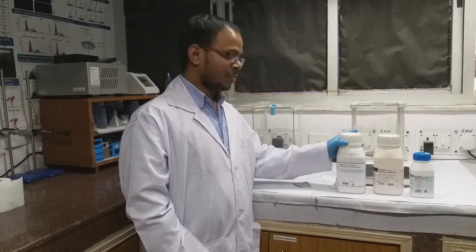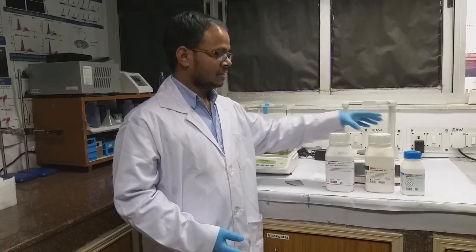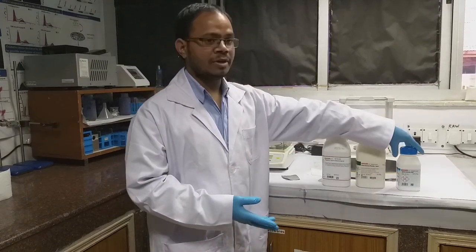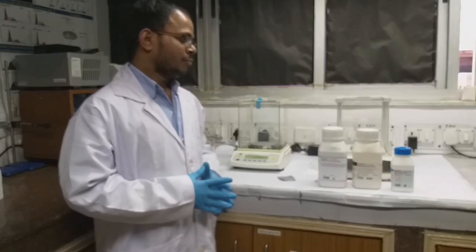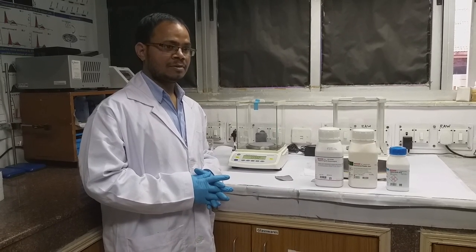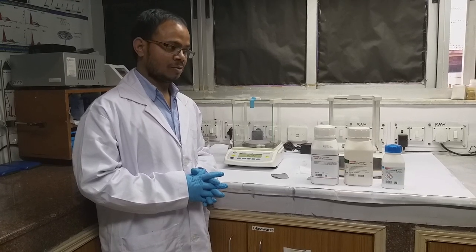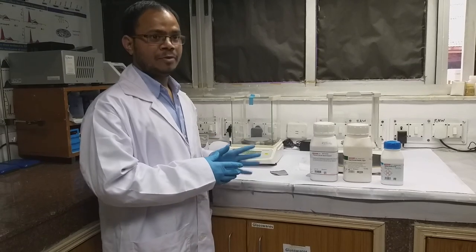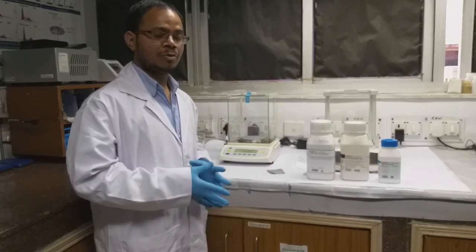One is peptone, yeast extract, and sodium chloride. For 100 ml of culture broth, we need 1 gram of peptone, 0.5 grams of yeast extract, and 1 gram of sodium chloride. I am going to weigh the individual components and dissolve them in double distilled water. Then we have to autoclave the media.